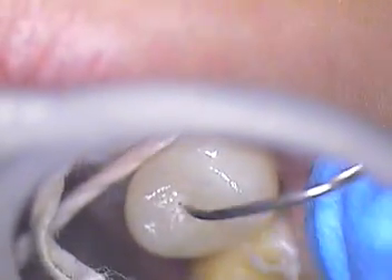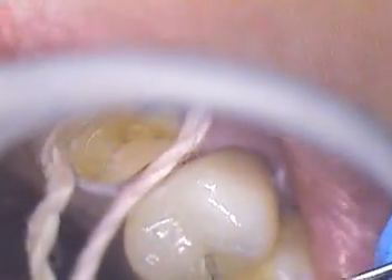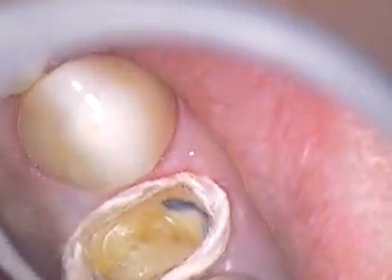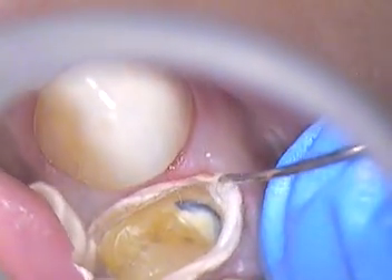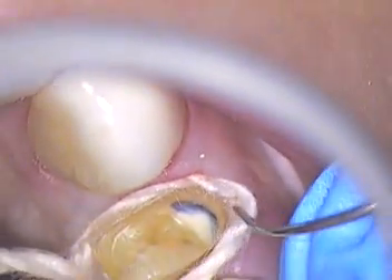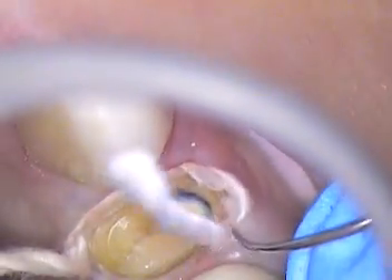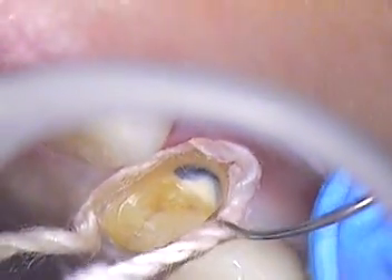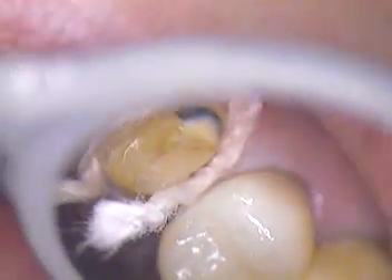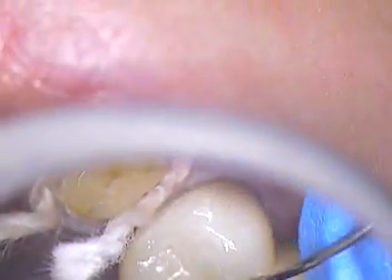There's still some material — see that? It was just sticking to that crown. I'm making sure I get it all out of there, it's so important. Certain surfaces attract that material — all it is is a bis-GMA, the Integrity material. We're just putting a small amount of cotton now under the gum.